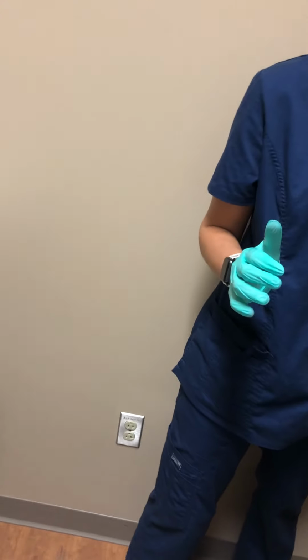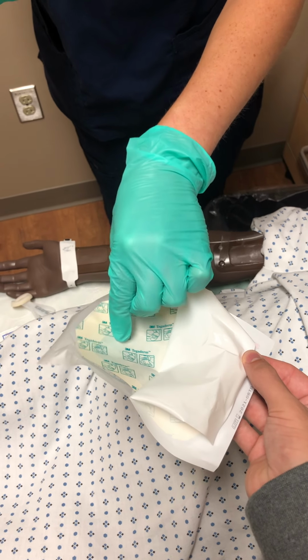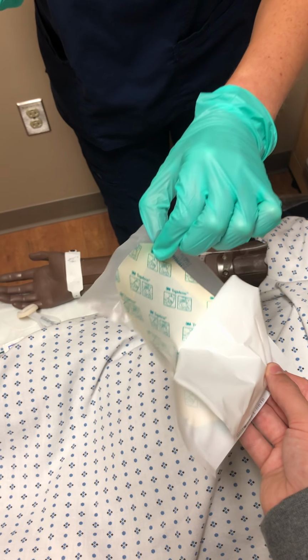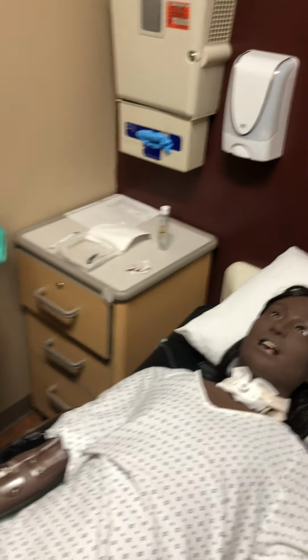This would normally be at the bottom of my catheter tray here, but for today's sake, don't touch it, and then I'll remain nice and sterile. So if you could open it up for me. Okay, so we have a sterile dressing at the bottom of this box.